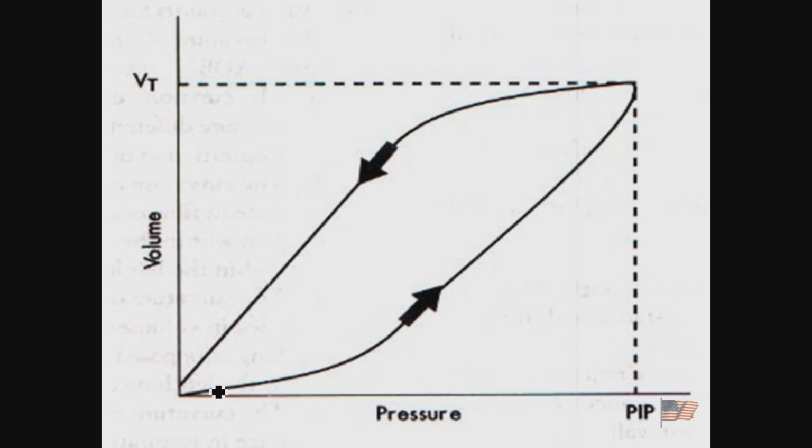And there's another example of a pressure volume loop on a mandatory breath, because everything's on the positive side of the tracing. I know that the patient is on 0 end expiratory pressure. How do I know that? Because it comes back to 0. This is my peak inspiratory pressure. This is the tidal volume that is generated with that. Inspiratory is always on the bottom, expiratory is always on the top. And you can see that, like a balloon, there are actually two different slopes here.